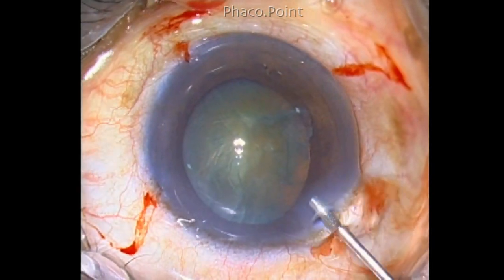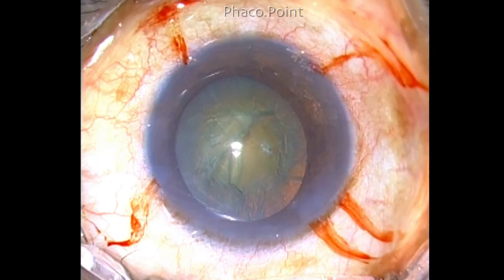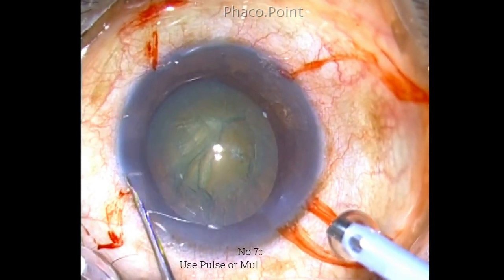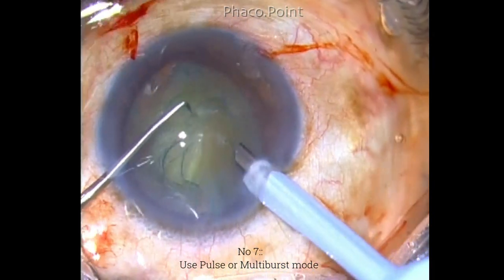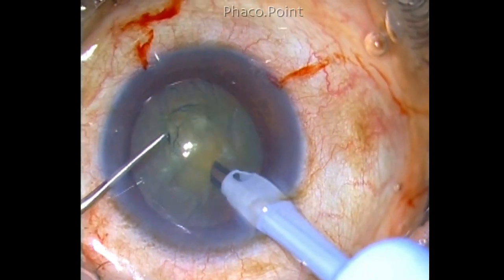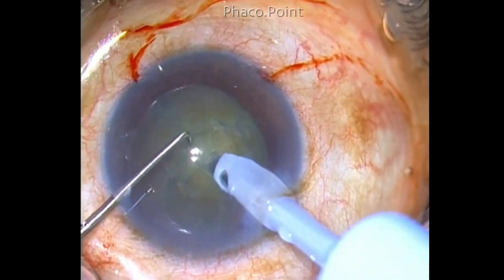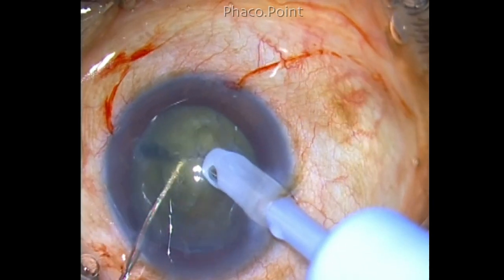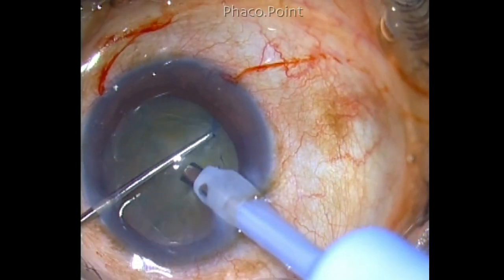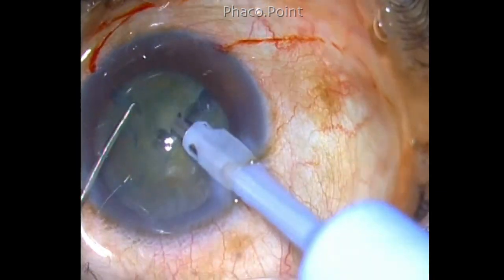Fill up the chamber with two percent HPMC and then proceed with the direct faco chop technique. You can use either the pulse mode or the burst mode of phaco. Set the power according to the grade of the nucleus sclerosis. Impale the phaco tip just above the midpoint of the nucleus. Make sure that the angle of attack is steep — that is, more than 45 degrees. Ensure that the phaco tip passes to at least 50 percent of the depth of the central nucleus core, and then use a sharp tip chopper and impale the nucleus just proximal to the phaco tip.